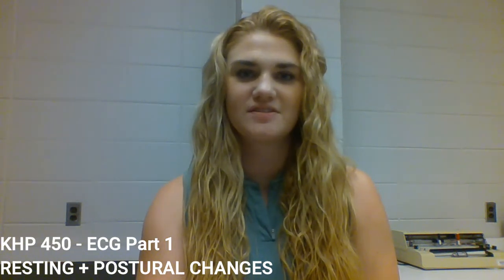Hi, my name is Rebecca, and I'm a graduate teaching assistant at the University of Kentucky for the Department of Kinesiology and Health Promotion. In today's lab, we will learn how to assess an individual's heart function through an electrocardiogram, or better known as an ECG.